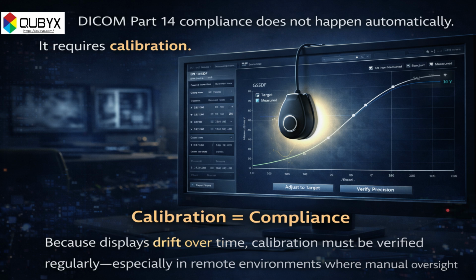It requires calibration. Calibration measures a display's actual luminance output and adjusts it to match the GSDF curve. Because displays drift over time, calibration must be verified regularly, especially in remote environments where manual oversight is limited.